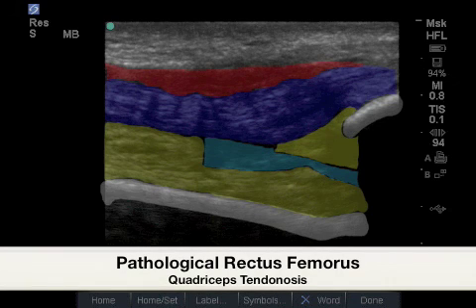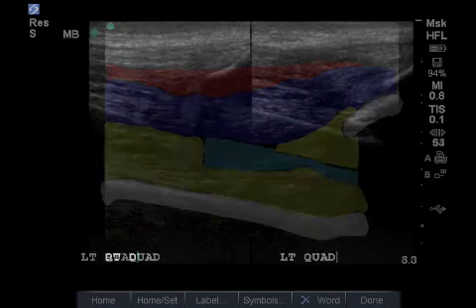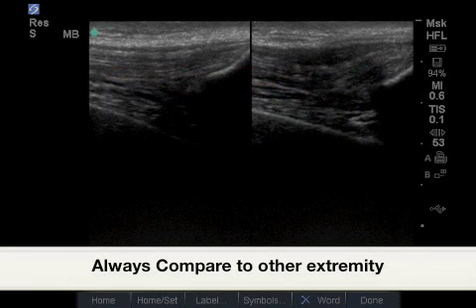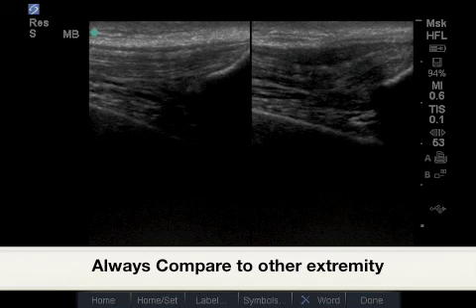In red is represented the superficial layer of the quadriceps tendon, which is now diffuse, indicating diffuse tendinosis of the rectus femoris portion.